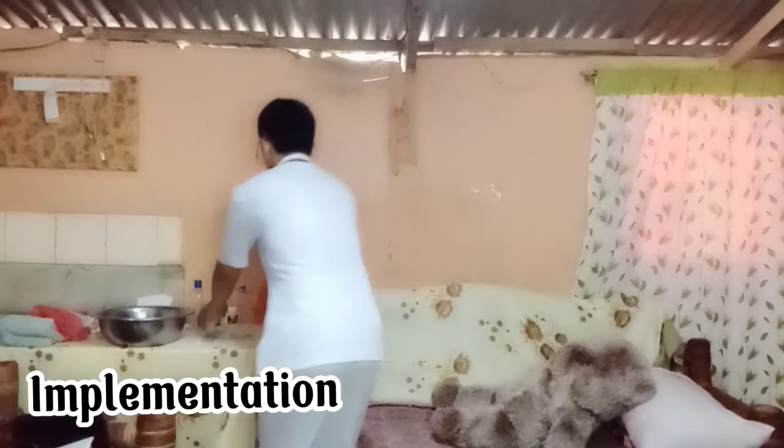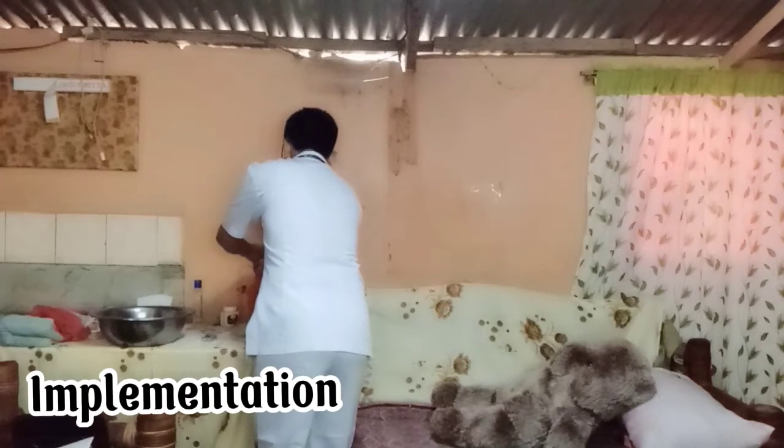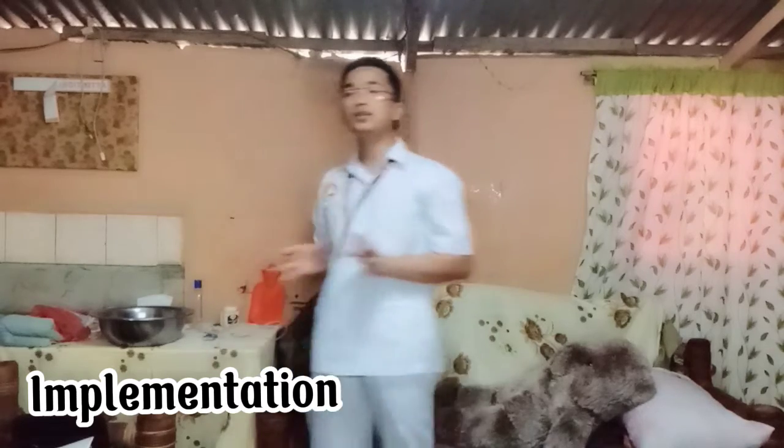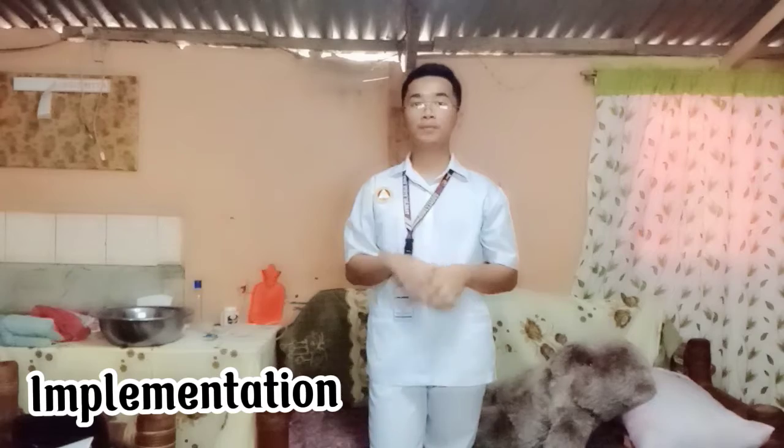Okay, so after we assemble all the equipment, we're now going to proceed to preparation. So we're going to put the right amount of enema in the drainage bag. Then make sure that you lock it. Then after that, we're going to lubricate about 5 cm to 2 inches of the rectal tube. Then run some solution through the connecting tubing of a large volume enema set and the rectal tube to expel air in the tubing, then close the clamp.